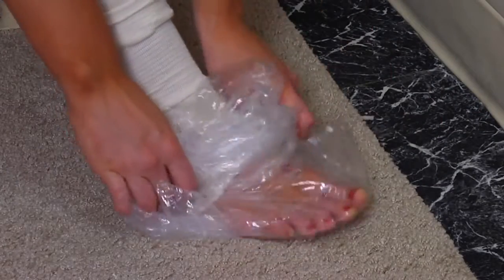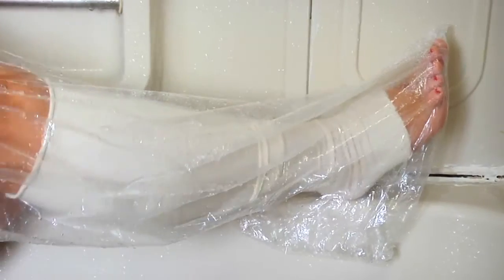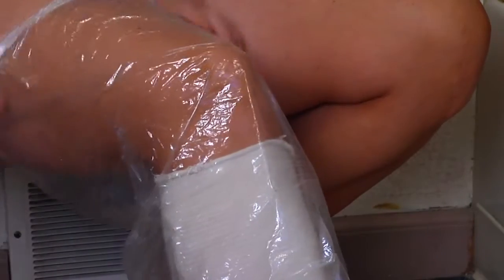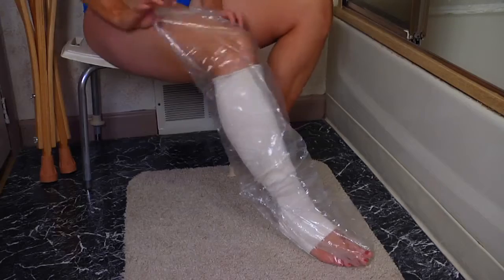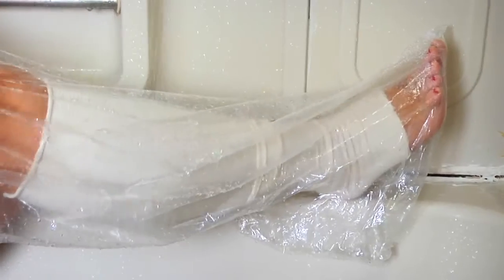The shower sock slips easily over a cast, allowing patients the ability to shower without the help of a nurse. The application is simple. Just position the shower sock over the area you want to protect, ensure the elastic bands on each end create a water-tight seal, and you're ready to take a shower.